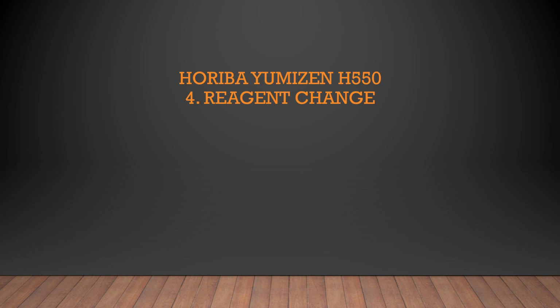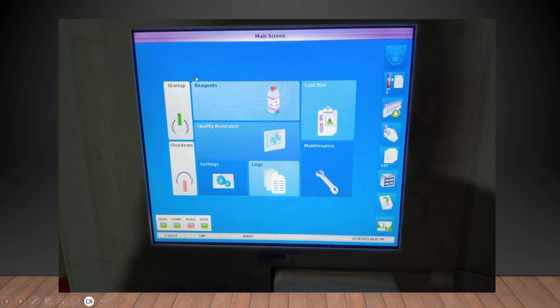Usually we go like this, but sometimes there is an occasion where in between the day also reagent needs to be changed. So during that time we have to change, there is no option. What we normally do, you go to the main window like this, and as you can see, this reagent has become red, so it is asking to be changed. So you click on the reagent.